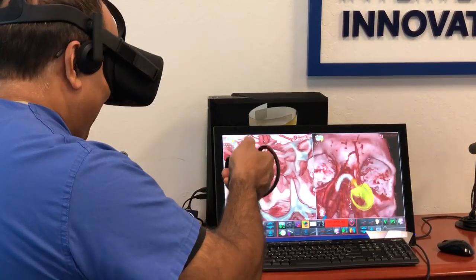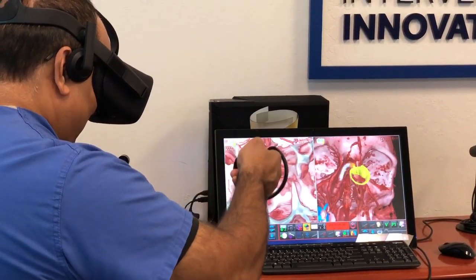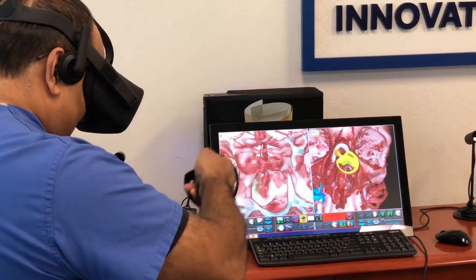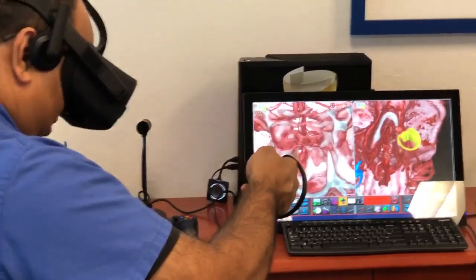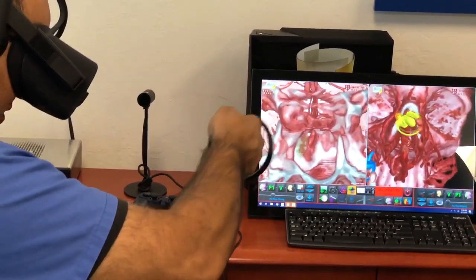You can kind of drill away. You can talk about like a virtual approach or virtual drilling, and basically make your... it's all in kind of space, so you get a sense of: okay, this is how big my opening is going to be, this is what I'm going to drill away, this is what I'm going to do.